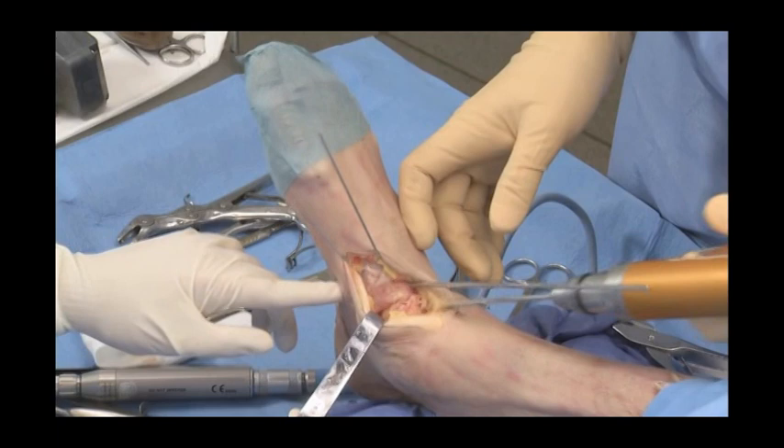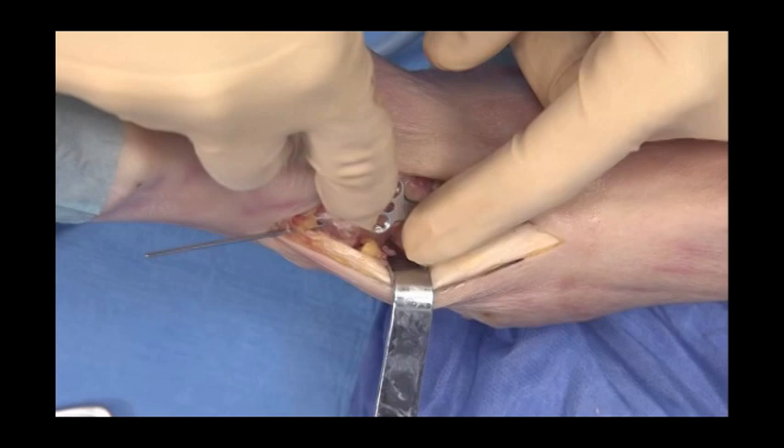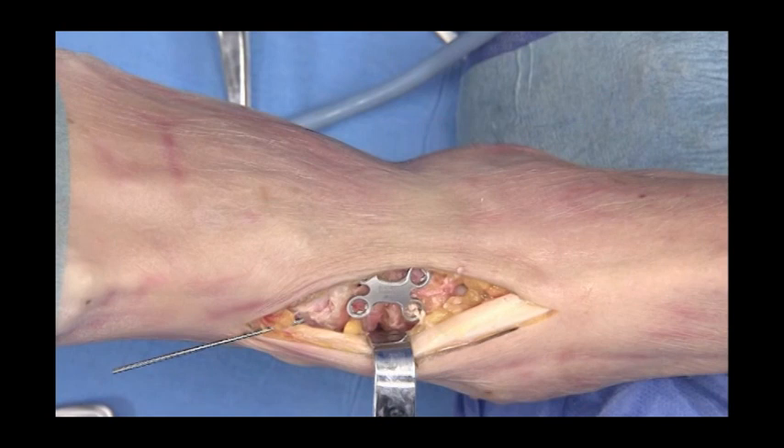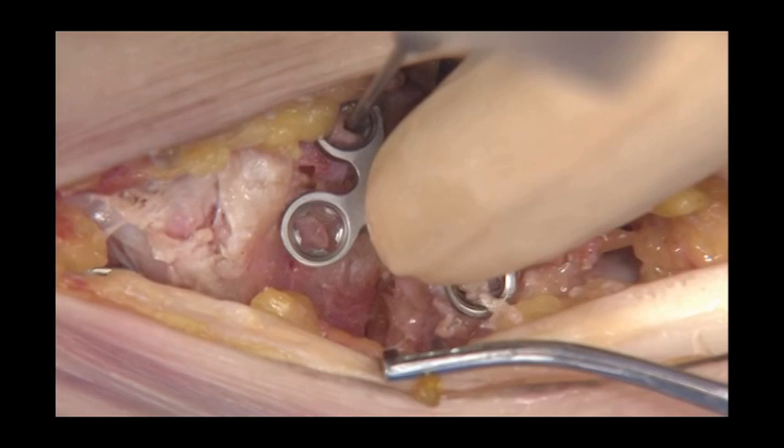Once compression is obtained, threaded pins are removed and a dorsal 3.5 peri-lock utility plate helps complete stabilising the joint. Make sure to avoid the neighbouring joints both from the screws in the subtalar joint and from the plate itself impinging on the ankle joint.